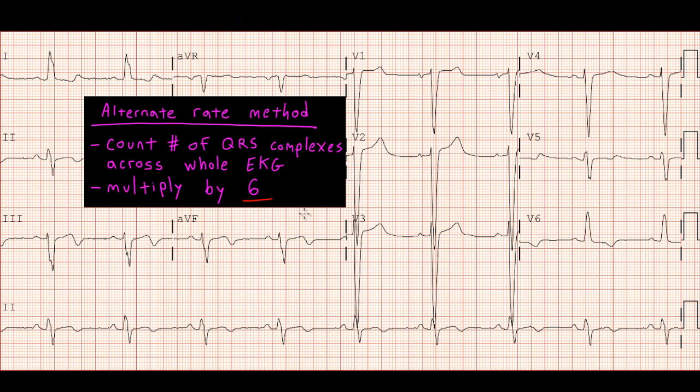So over here we can see we've got 1, 2, 3, 4, 5, 6, 7, 8, 9 QRS complexes. 9 times 6 is, wait, let me get my calculator. No, just kidding, I don't need it. 9 times 6 is 54.